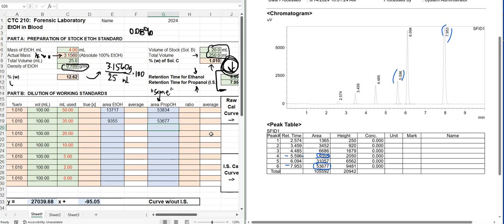But if I see that number skyrocket high or plummet low, that means that there's something weird that happened with that machine at that moment in time. And I can't trust that data because it doesn't match what it should. And that is being consistent, for the most part, across the board. All right, so these slight differences we can account for a little bit later on.